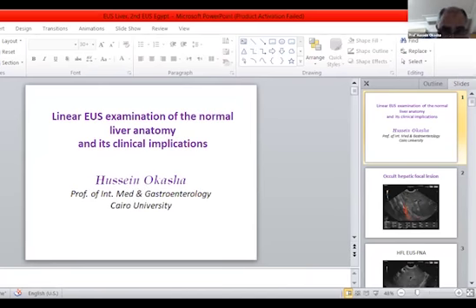Thank you. I have a question, Dr. Hussein, please. Yes. Shall we sample every hepatic focal lesion we find? Sometimes in evaluation of pancreatic head masses, we find a hyperechoic hepatic focal lesion and we suspect that it is a hemangioma. But in such a situation, shall we sample such a lesion, or depend on another imaging, such as a PET scan? Yes, a very good question.